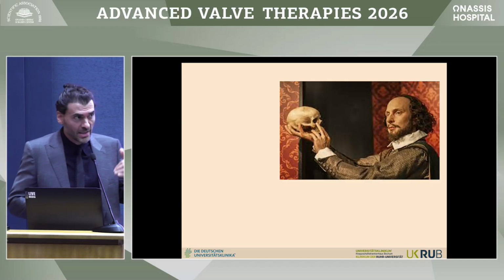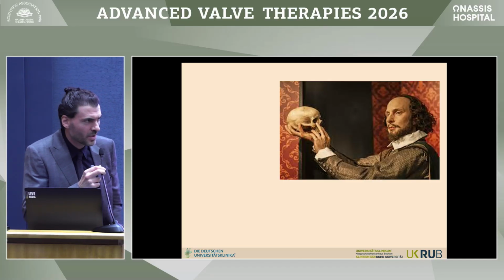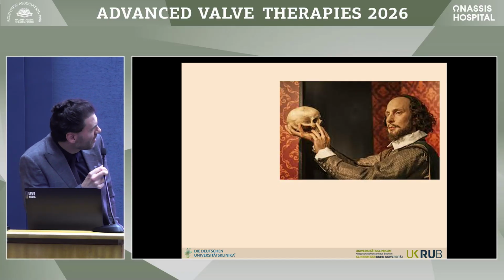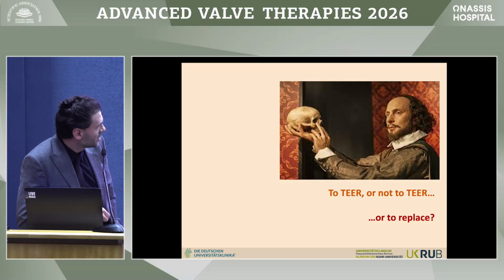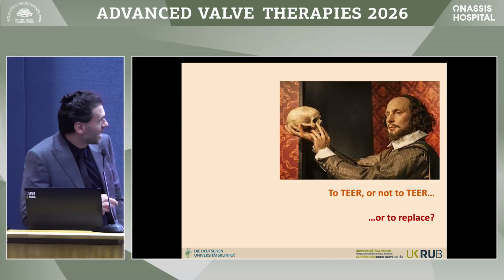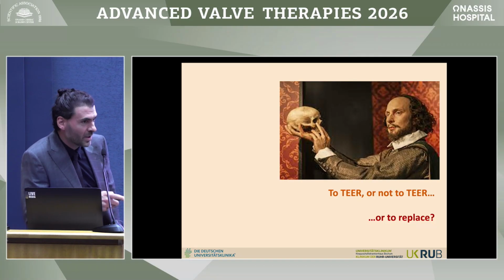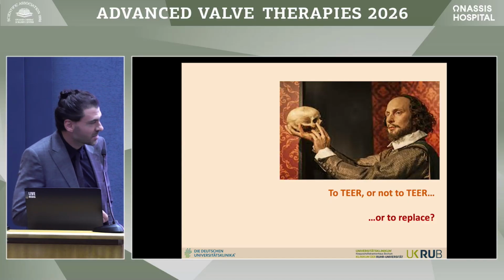So yesterday I asked the question, to stent or not to stent. I thought Shakespeare and Hamlet, that was the question. Maybe I was wrong. It was not to stent or not to stent. I think he said to TEER or not to TEER. I'm going to get that by the end of the weekend. And or to replace. Don't worry, Ioannis, I will not talk about replacement. Mr. Spargias will do that later.